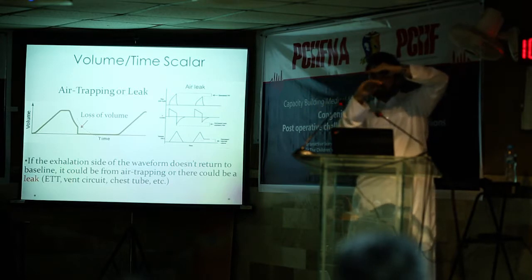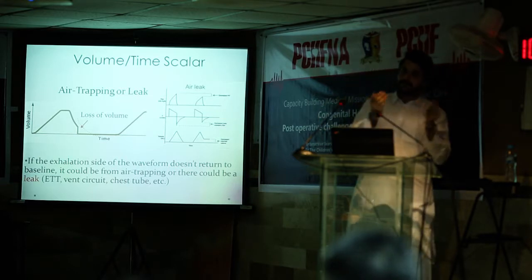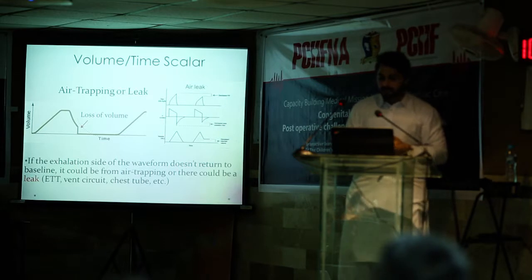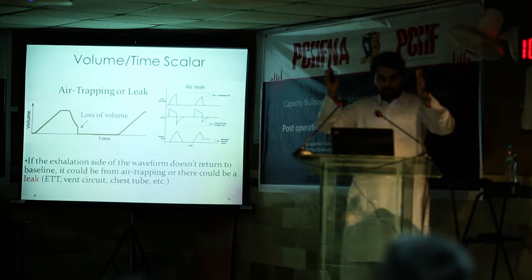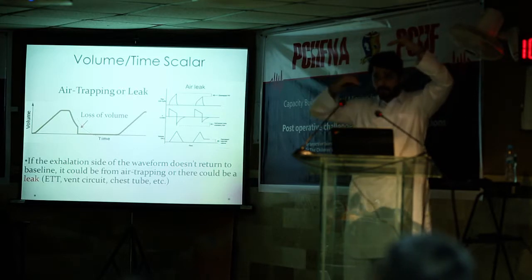because there is a leak. So when the patient exhales, it doesn't come back to the baseline. It's the same as air trapping, because we said in air trapping it also doesn't come back to the baseline. But the main thing to differentiate between these two, again, is the pressure. In air trapping, pressure is high; in a leak, pressure is low.